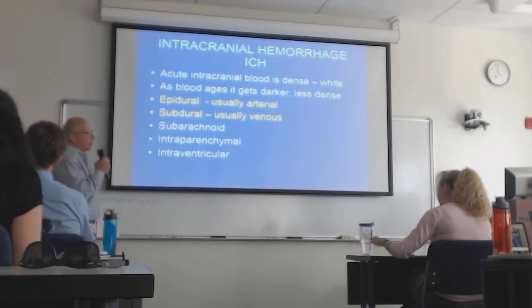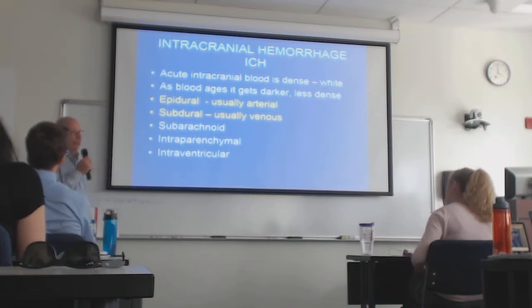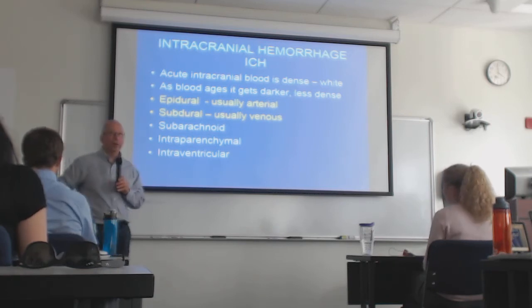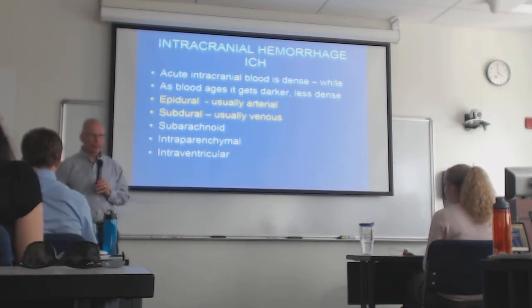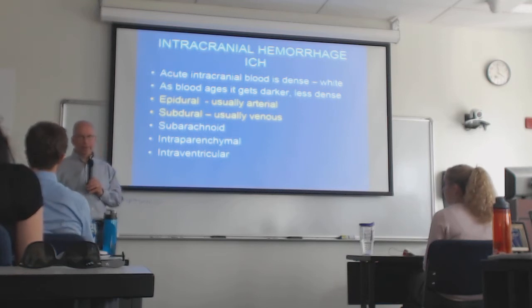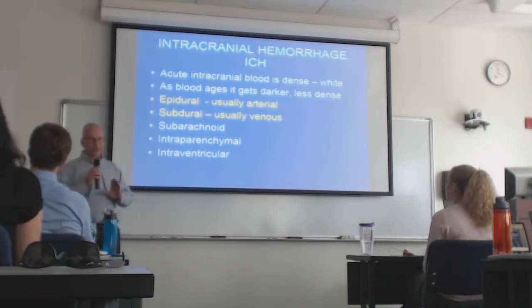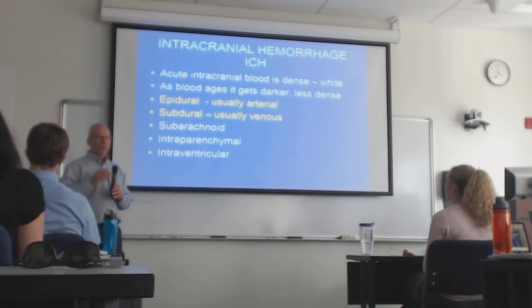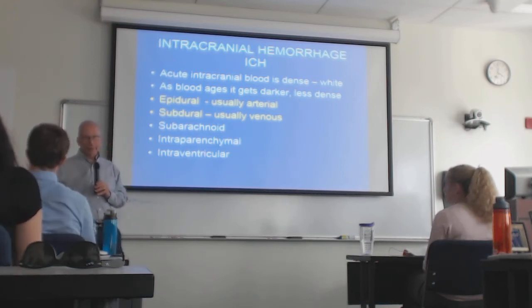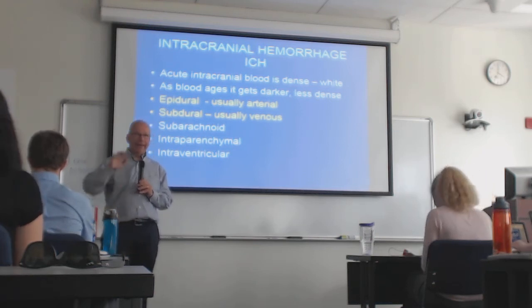So what we're looking for in the brain when we're looking for intracranial hemorrhage will depend on how fresh or old the hemorrhage is. Obviously, if someone gets in an MVA and goes to the ER within an hour, and is suspected of having intracranial hemorrhage, it's going to be pretty fresh. For reasons that are absolutely unnecessary for you to bother yourselves with, fresh hemorrhage in the brain looks white on a CT scan, okay?